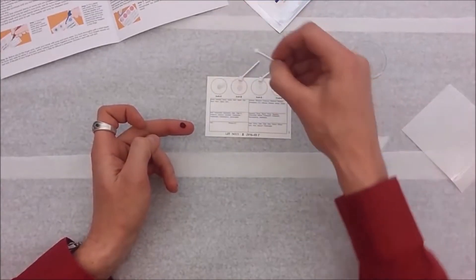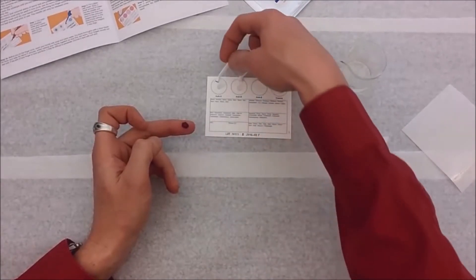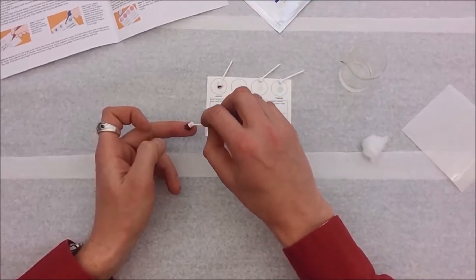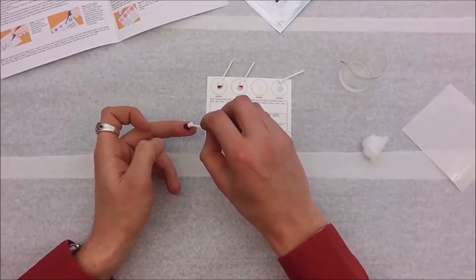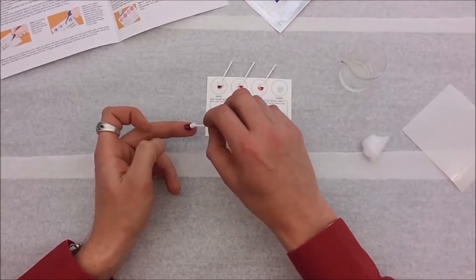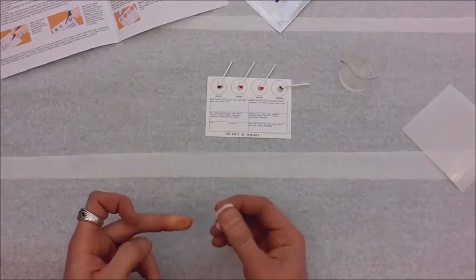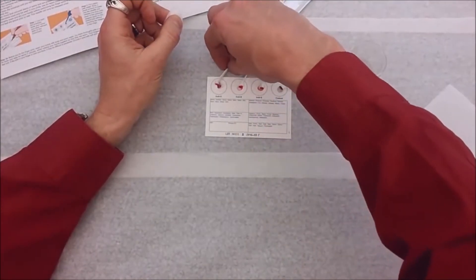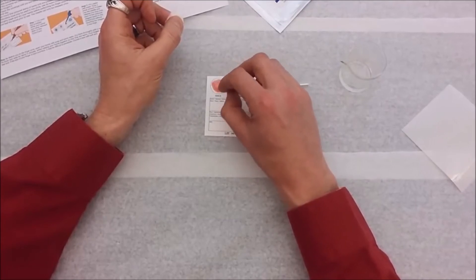Once your blood starts flowing, grab one of these little spatulas and get a little sample — it doesn't take much, just a little drop — and set it in the liquid on the card. Do that for each of the spatulas to get a blood sample in each circle. Now I'm done with the bleeding so I can put a cotton ball over my wound.